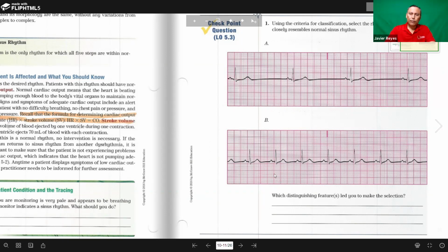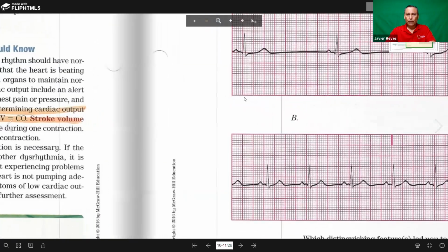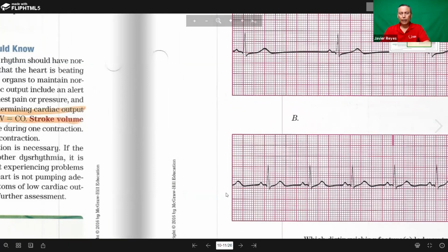And the last thing we have to evaluate is the QRS duration. How wide is the QRS? Can you all tell how wide this one is? That's pretty close. I think y'all can tell, right? How many little squares? I think it's 1 or 2. I can't really see. 1.5, right? Más o menos, 1.5. That's exactly 0.06 to point what? 0.10. To 0.10 is the normal QRS duration.